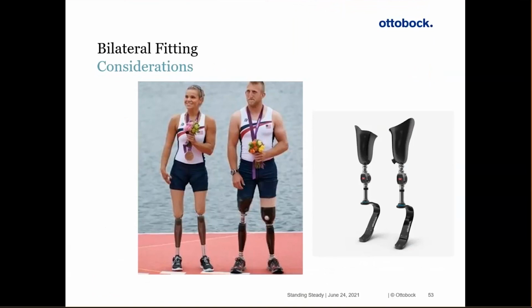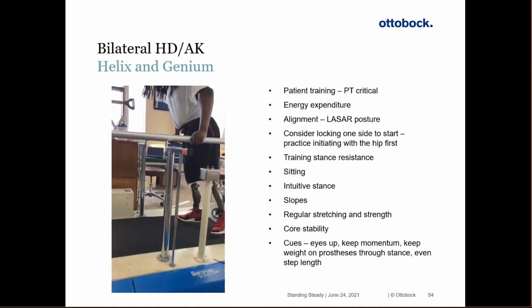All right, so looking at bilateral users overall, each user presents with unique situations, goals, and challenges, and it's really imperative to take that time and spend some time on training as well, so that these end users can achieve their desired outcomes. Perhaps even end up on the podium somewhere, run, do all of those exciting things that we see on the internet today. Maybe they just want to walk, and that's completely enough, so just always evaluating that entire picture and perspective.